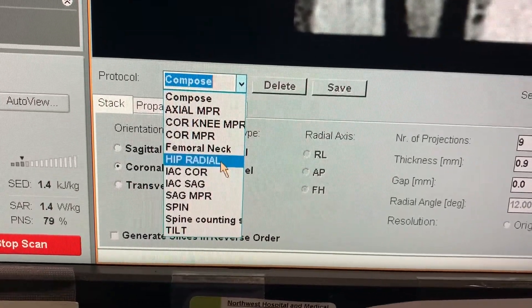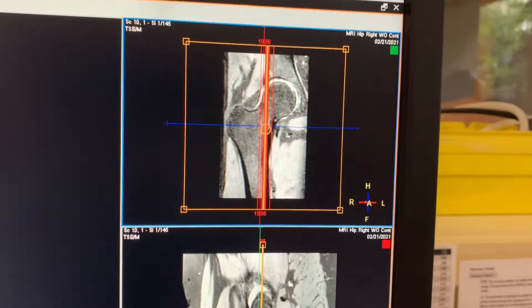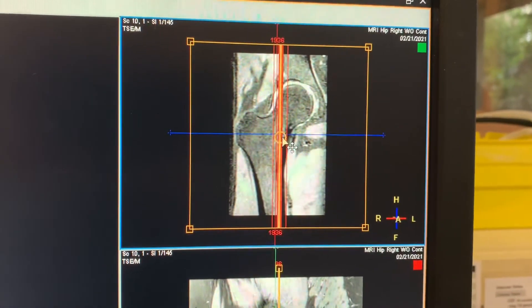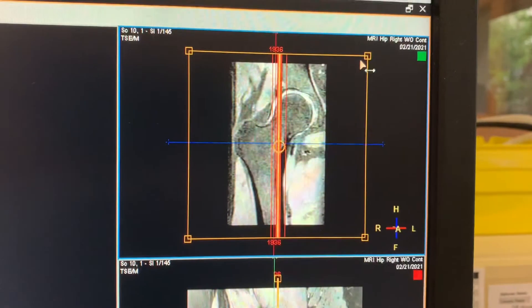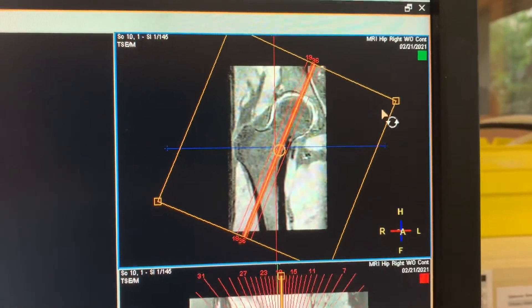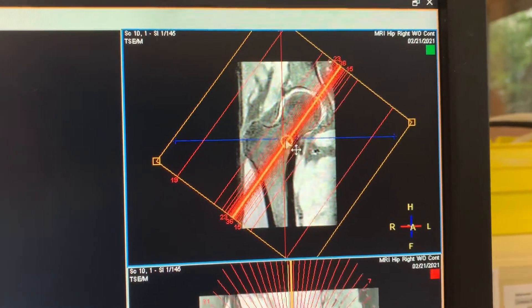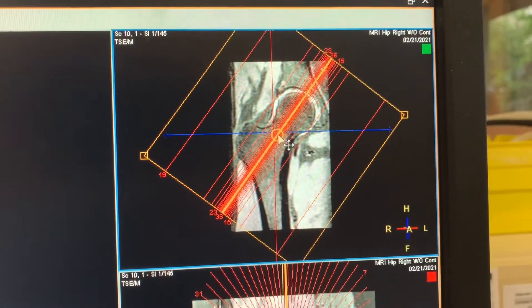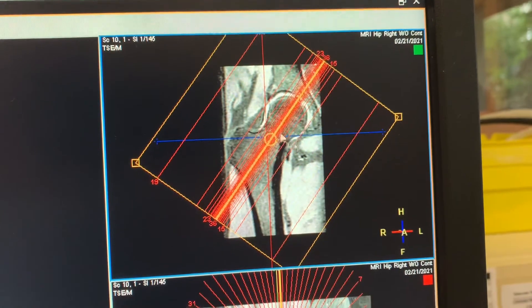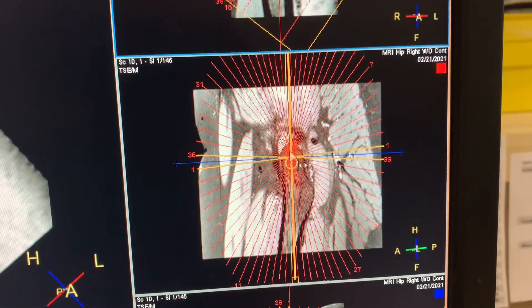Once you select that, the key point is you have to angle the coronal plane clockwise to be parallel with the femoral neck. You have to be precise about it — they want you to be really precise.